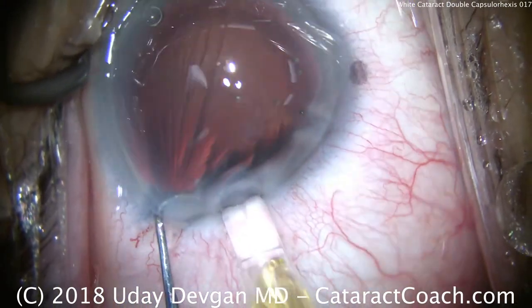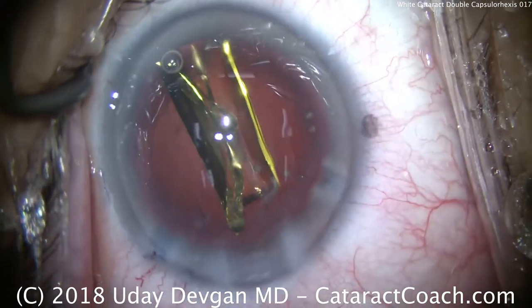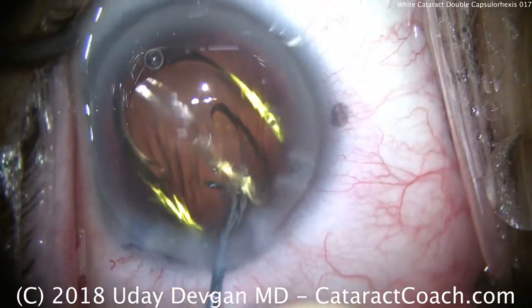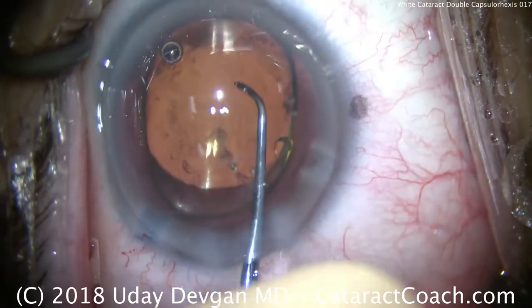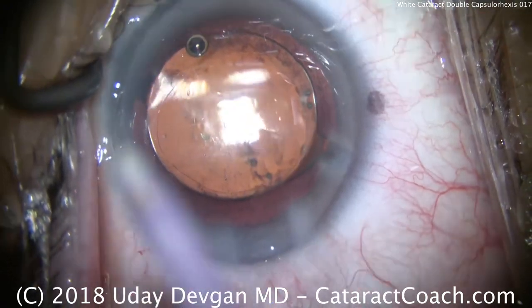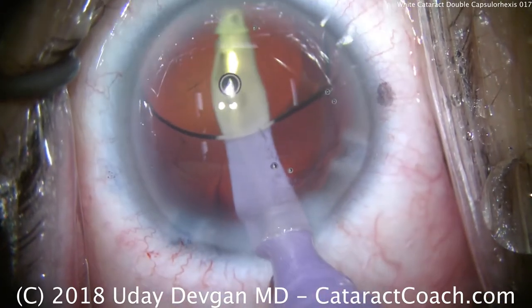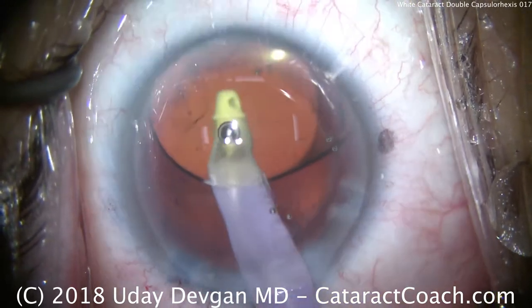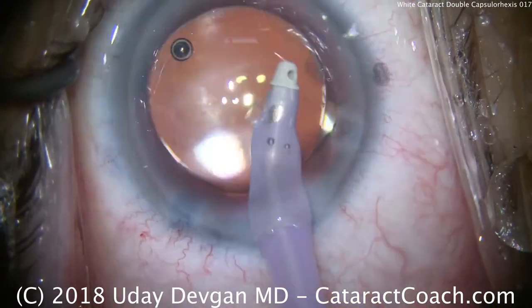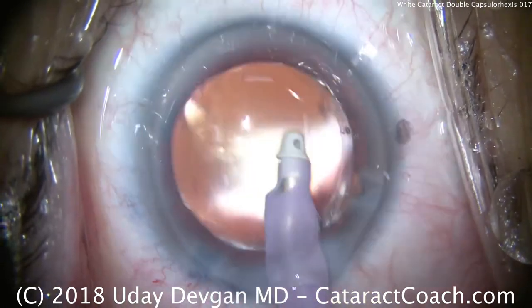The IOL is going to be implanted down in the capsular bag. There's a single-piece acrylic monofocal lens that goes beautifully within the capsular bag. We'll use our chopper to position the lens. This lens has a 6mm optic, and we'll see that our second capsulorexis of 5mm will overlap it nicely. We rotate the lens, and the reason is that'll help free up any residual cortex or lens material trapped at the equator of the capsular bag. Going behind the lens now to remove the viscoelastic — this is starting to look pretty good. You can see the overlap of the rexis on top of that optic, which looks great.